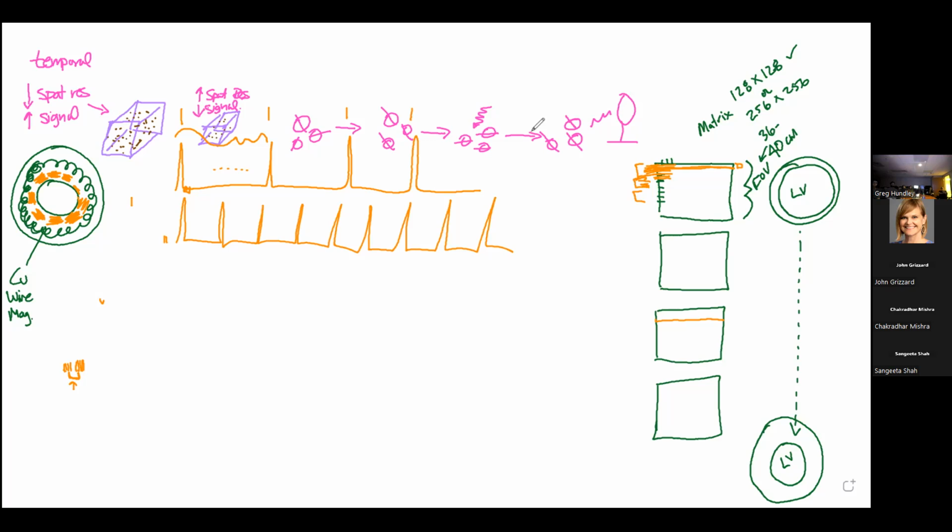In this situation, though, we've got to keep our temporal resolution sufficient so that we can identify end systole over here on the right side of the screen. We've got to be able to identify the time interval that's end diastole and end systole. Well, if we keep our old strategy and take this group and this group and this group, similar to what we did up here.